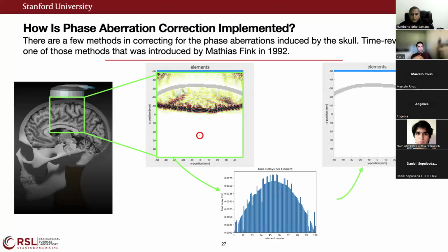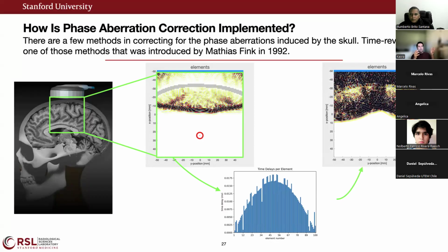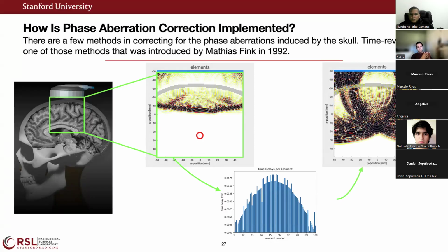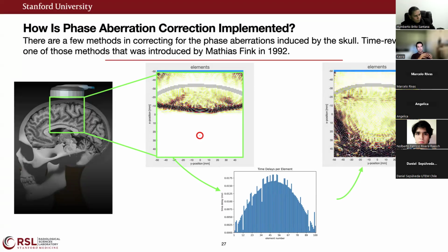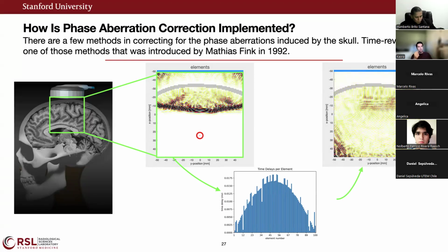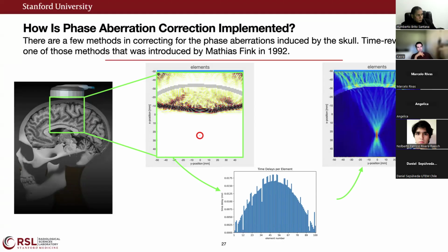Now this time put your elements in transmit mode and generate your sound beams. And you ought to be able to have this constructive interference at the focus. Once again, note that when I turned this animation on and ran it forward, the elements on the periphery turned on first. They fired first simply because they had a longer path to travel towards the intended focus, whereas the elements in the center fired last.